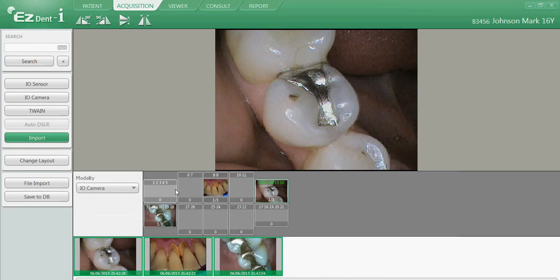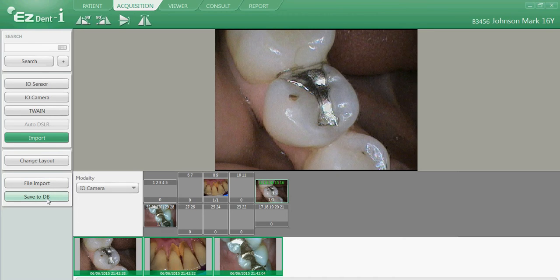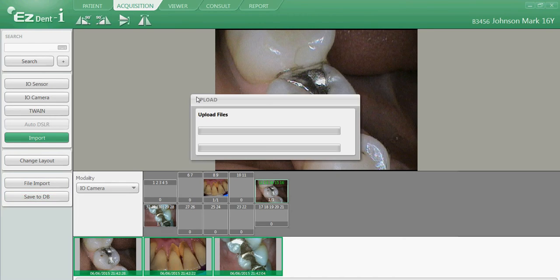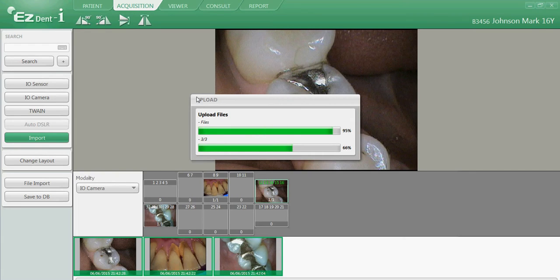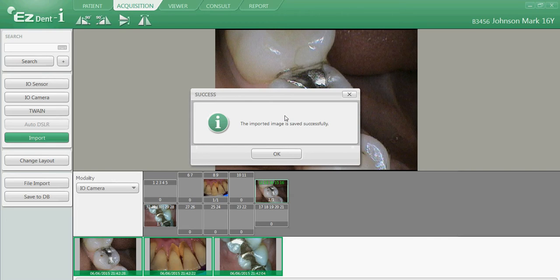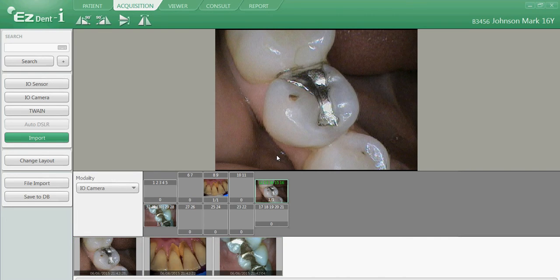Once we've captured and imported all of our images into the patient's chart, under File Import, select Save to DB or Database. Once it's completed successfully, close out the message window, and the images have now been added to the patient's chart within the EasyDent Eye software.